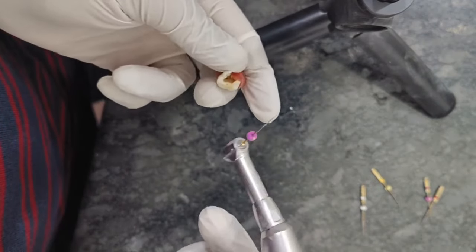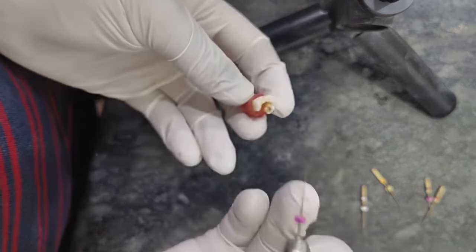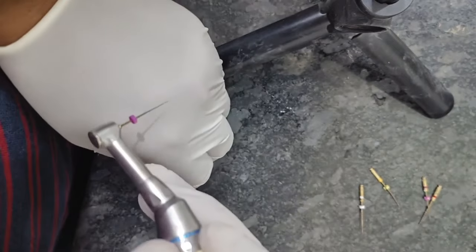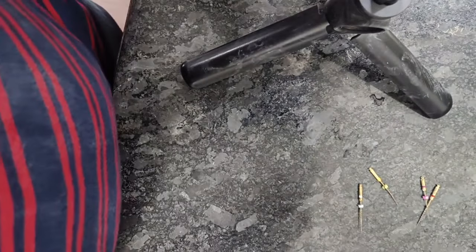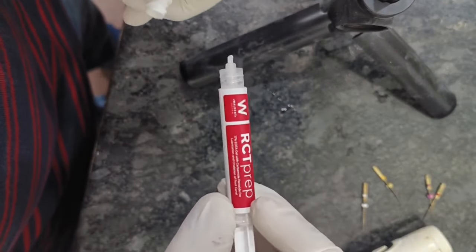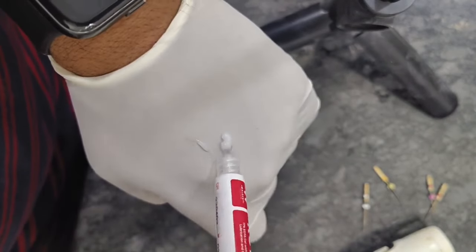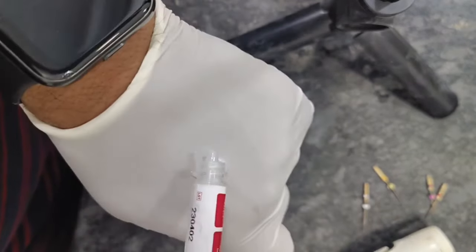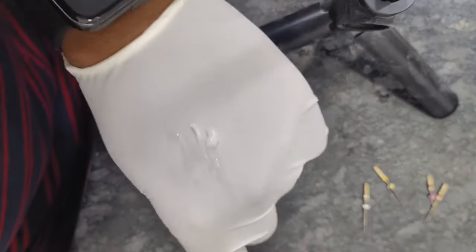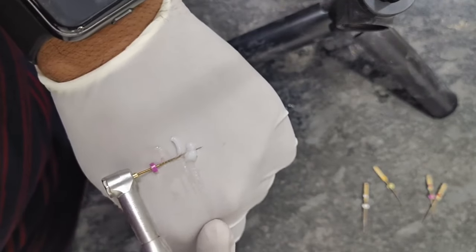So in this part, you can see here, this is the file. And here I am again with the same motion. You have to use a little bit of gel. I am using this 17% gel. I'll just take it in my hand a little bit. You can also use the 17% liquid, which is available. I think the liquid one is more favorable than this gel, because it very easily goes into the canal. So just introduce a little bit of gel like this.